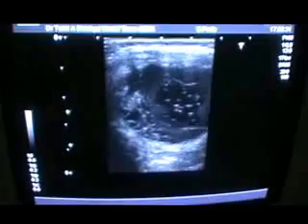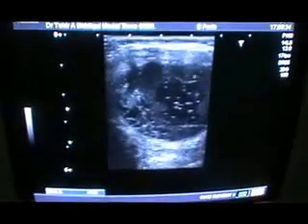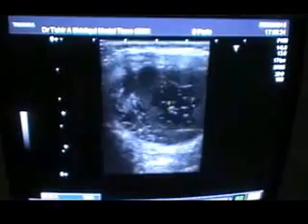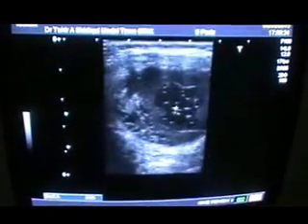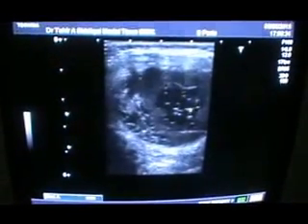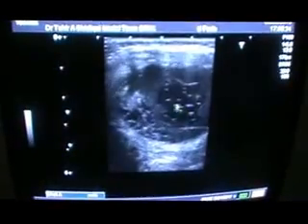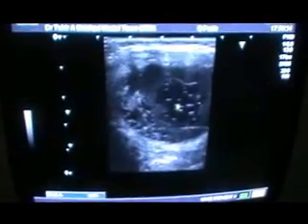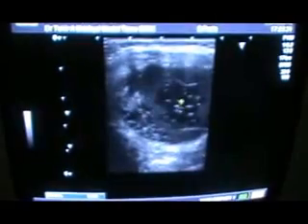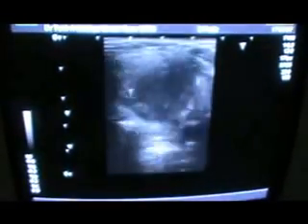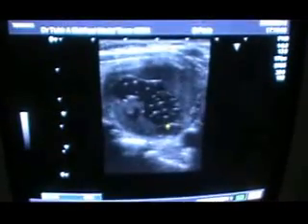You see, this is the thick echogenic band, with an internal cystic area containing tiny echogenic particles. A few are giving comet-tail artifacts, consistent with some cholesterol calculi. And there are septals within it — it contains septations.